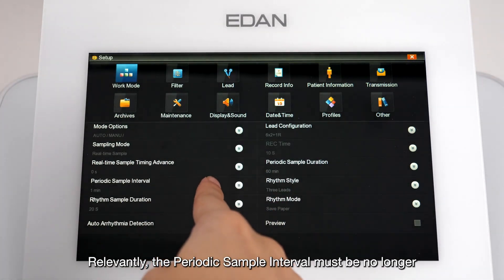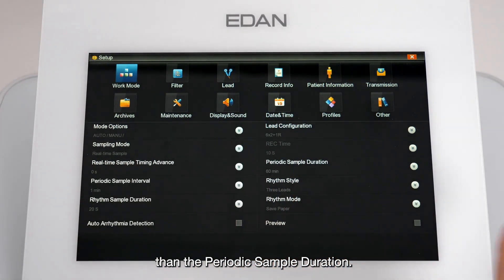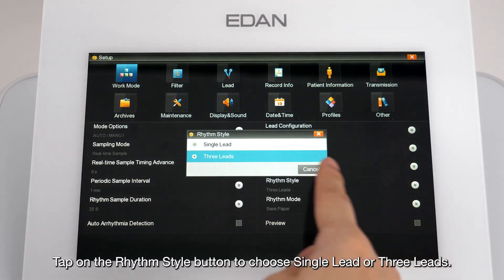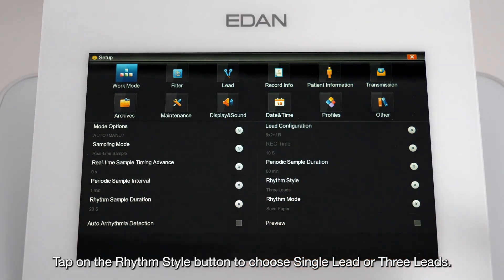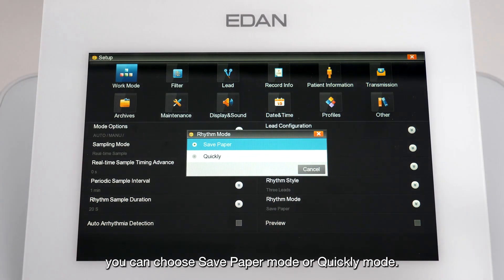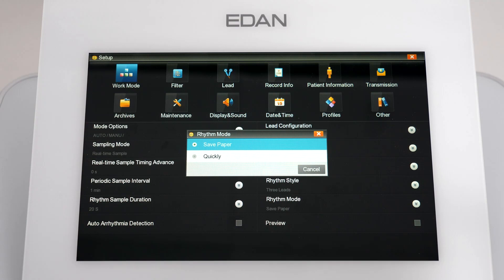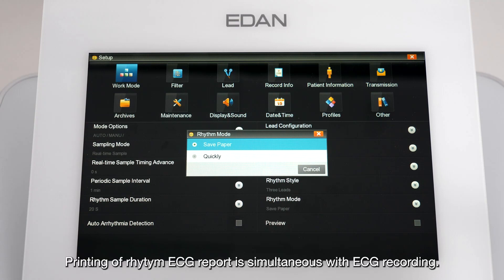The periodic sample interval must be no longer than the periodic sample duration. Tap the Rhythm Style button to choose single lead or three leads. In the Rhythm Mode submenu, you can choose Save Paper mode or Quickly mode. Selecting Save Paper prints the rhythm ECG report after acquisition is finished; selecting Quickly prints the rhythm ECG report simultaneously with ECG recording.